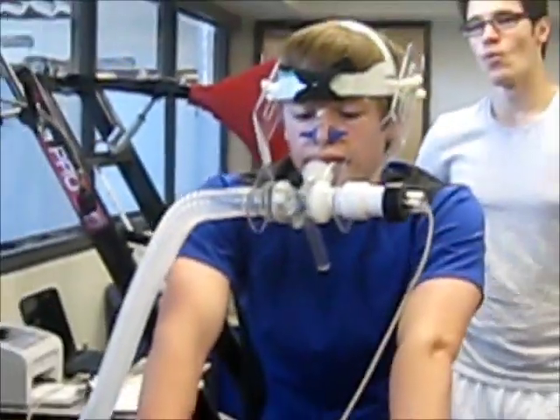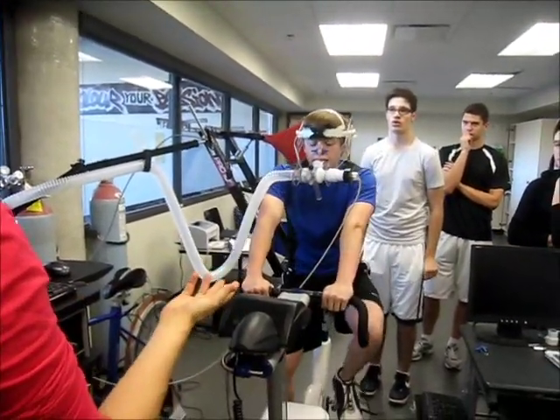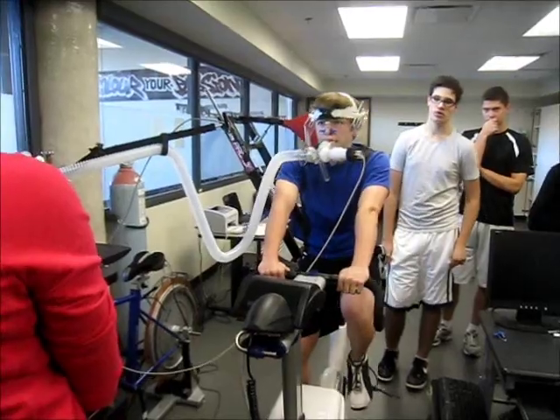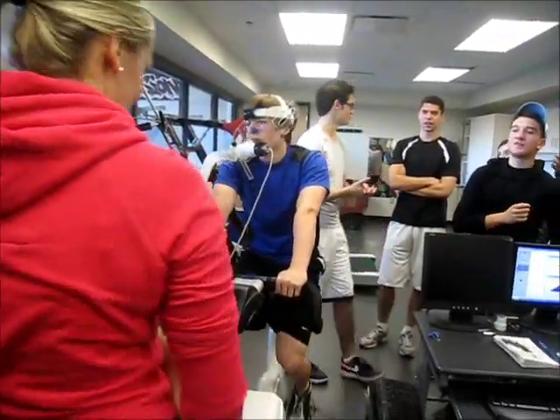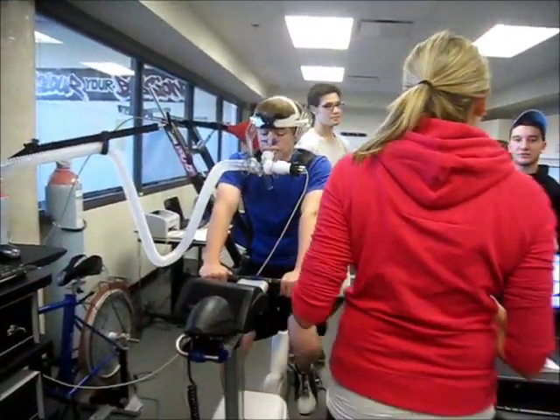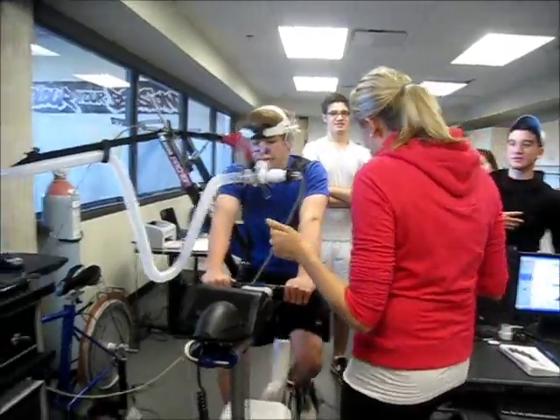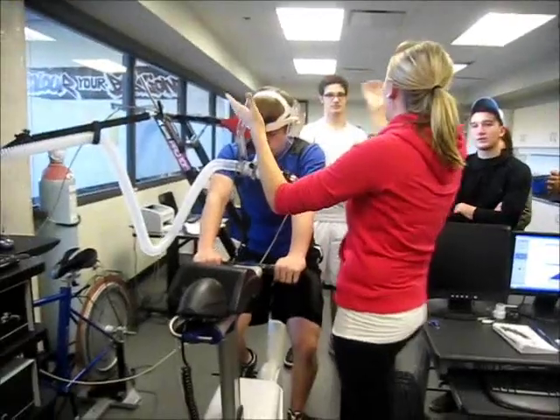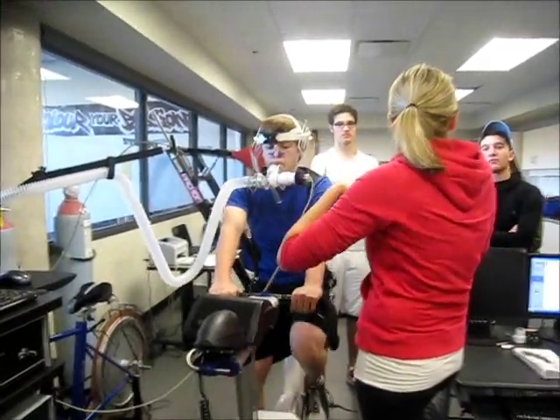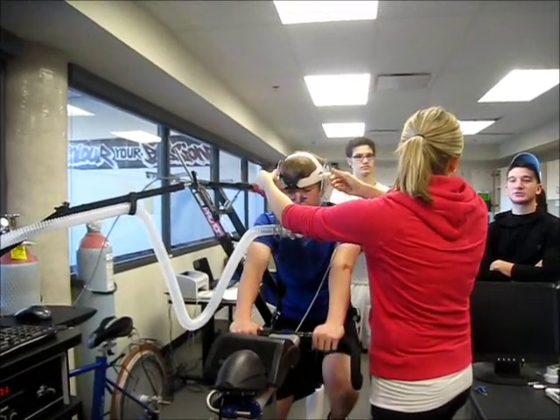His heart rate got to 202, which is essentially his max predicted heart rate. So we would like to think that probably was his VO2 max — he didn't give up too early. And his VO2 is 55! If you were on pure oxygen, would you be able to take more? Yeah — you can manipulate the air you're breathing in to make it easier if you make oxygen delivery easier. I think it's done — heart rate is positive. It's amazing.